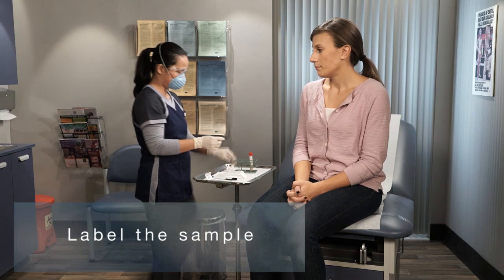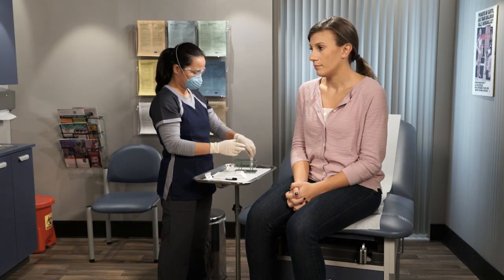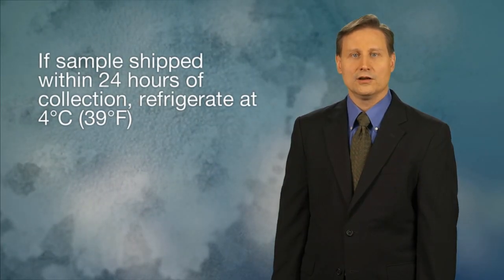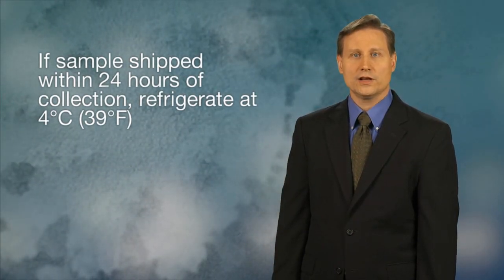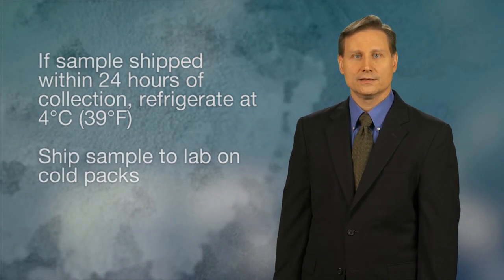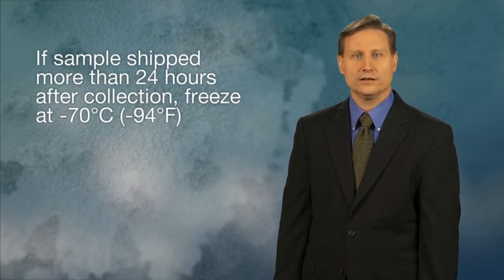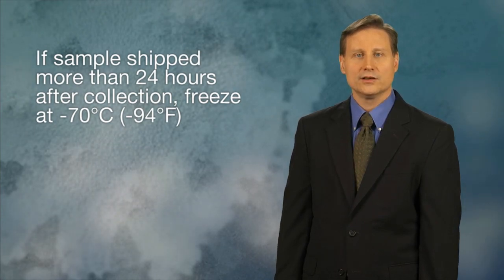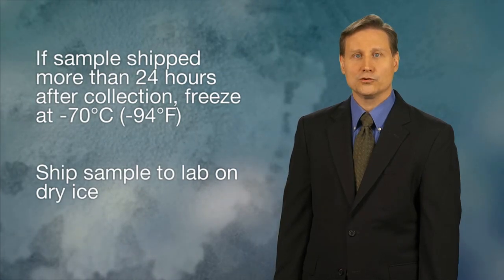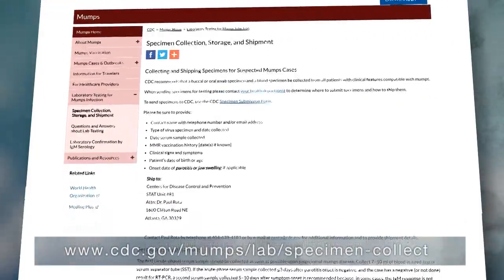Label the sample. If the sample is shipped within 24 hours of collection, refrigerate at 4 degrees Celsius, which is 39 degrees Fahrenheit, and ship the sample to the laboratory on cold packs. If the sample is shipped more than 24 hours after collection, freeze at minus 70 degrees Celsius, which is minus 94 degrees Fahrenheit, and ship the sample to the laboratory on dry ice. For more information on collecting and shipping specimens, visit this CDC webpage.